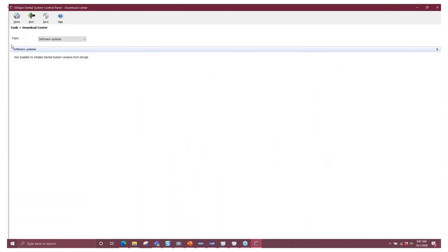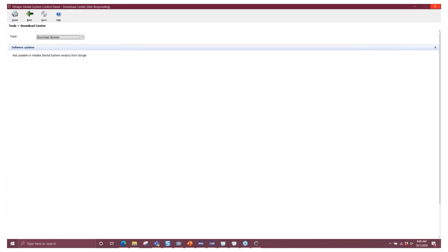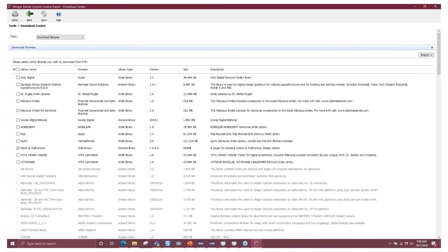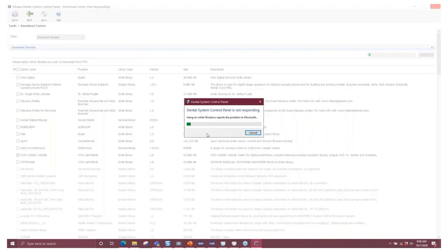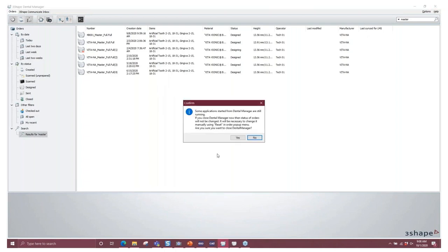In the Control Panel, navigate down under Tools to the Download Center. Change your topic to Download Libraries — it'll take a moment to load. Then select the Vita Bionic Vigo and click Import. Once it's finished importing, you're going to want to save. It will finish, it will save, and after the changes are made it will restart your Dental Manager, and then you know the changes have taken place.